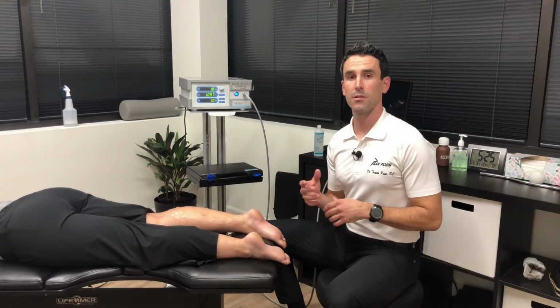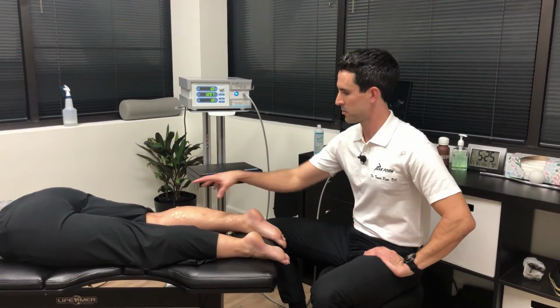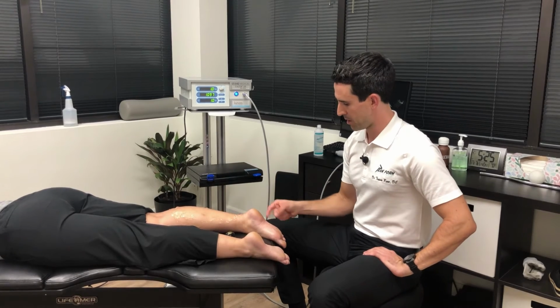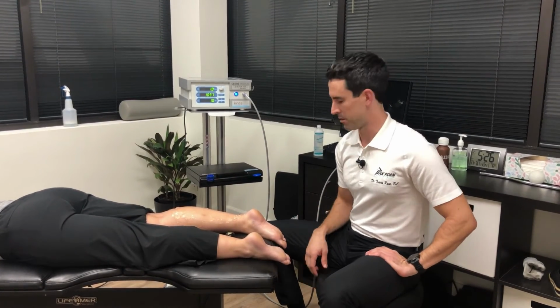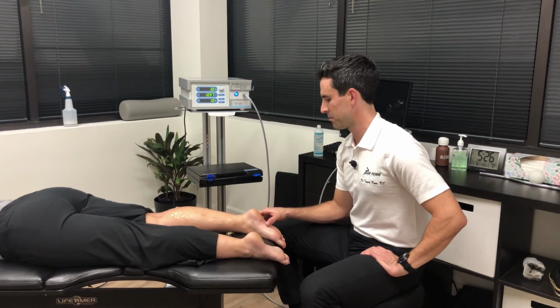Okay, so that's a typical shockwave treatment that we would do for plantar fasciitis. Again, loosening up the calf musculature and the bottom of the foot, and then we get real focused in right on that insertion site of the plantar fascia on the bottom part of the heel bone there.